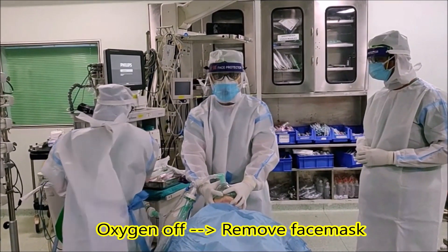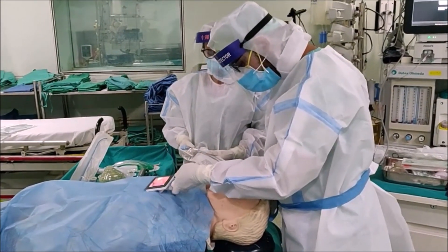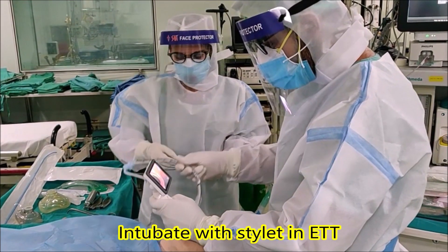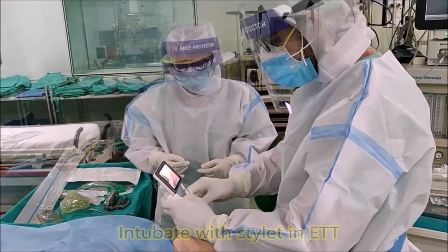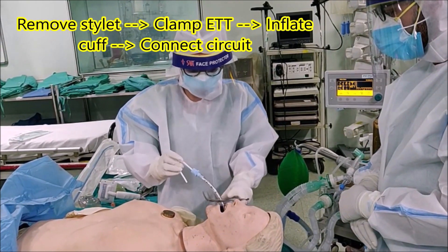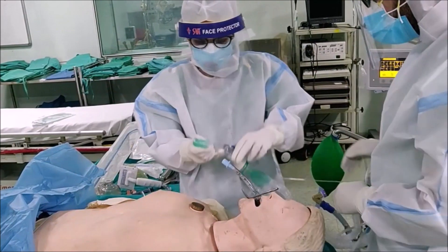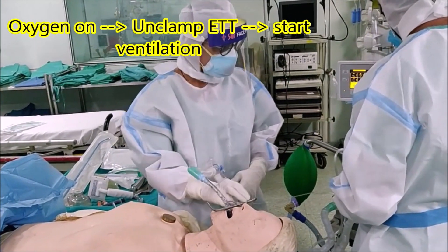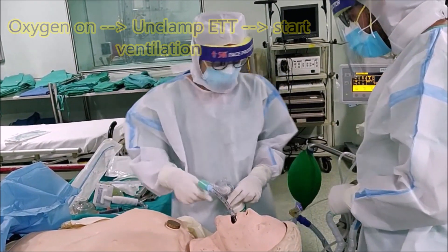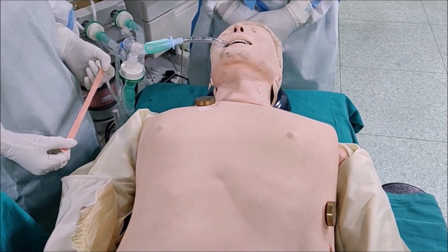Close oxygen. Oxygen out. The vocal cords are visible. Tube is past the cords. Stilet is removed. Tube is clamped. Cuff is inflated. Circuit is connected. Oxygen is on. Clamp is off. Let's ventilate. We have bilateral chest rise and capnography.